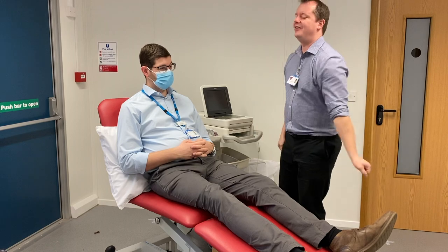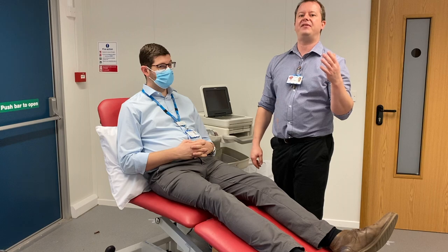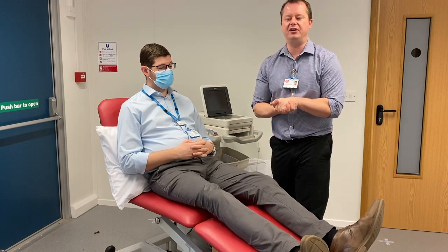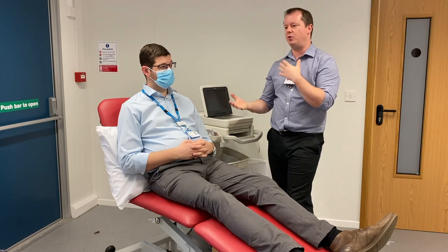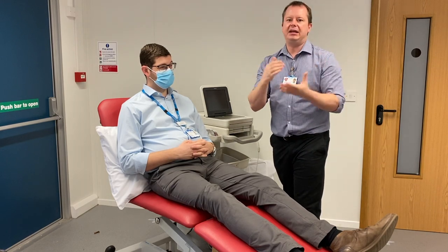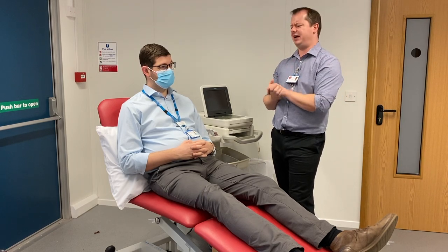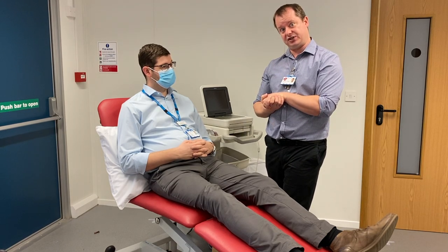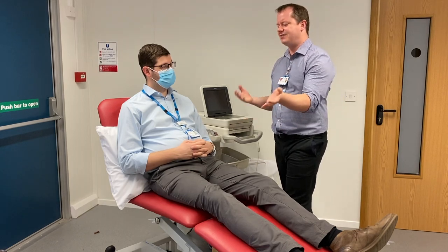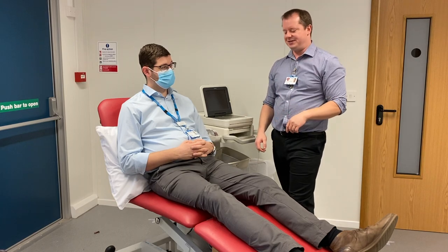Once we've got consent, we can go ahead and do the test. It might be really worth thinking about having a chaperone. Some literature says you should ask the patient if they'd like a chaperone. I tend to just say I'm going to get someone to help me do this test, because if I asked a patient 'would you like a chaperone?' and they said 'no, just you and me,' I'd feel a bit uncomfortable. So I just get someone to help — like Tina, who's behind the camera — to come and help me do the procedure.